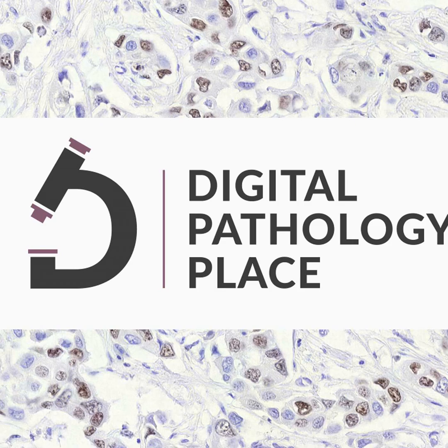Side note, that means that we no longer have to say how brown an object is, how big, how round, or anything like that. We just draw examples. Examples of positive cells, examples of tumor nuclei, examples of stroma, and we no longer have to worry about actually describing them in any way that a computer would understand.